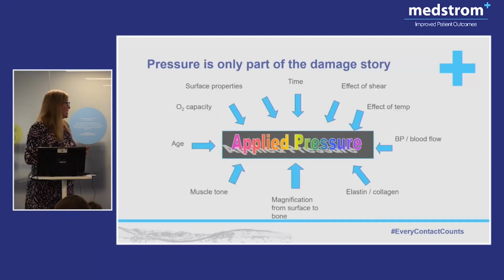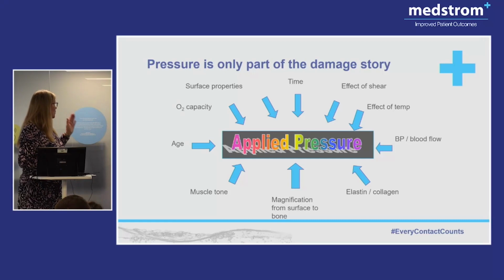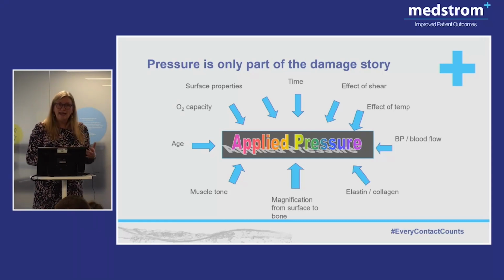But pressure's only a small part of the story, because you can all tolerate a very, very high pressure for a small amount of time. If I asked some of you to just perch on the edge of the window for a little while, you'd manage it for a couple of minutes, and then you'd say, I'm bored with this, I want to sit on there because it's hurting me. So pressure and time is important, effects of shear are important. There's a whole range of things.